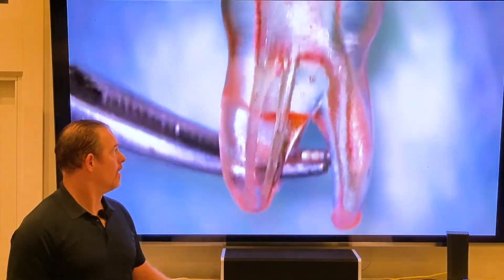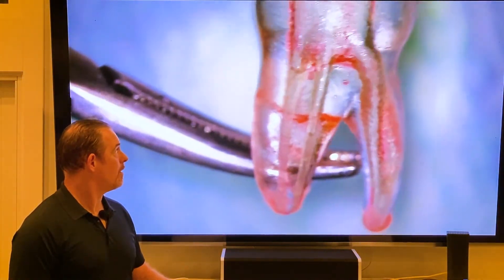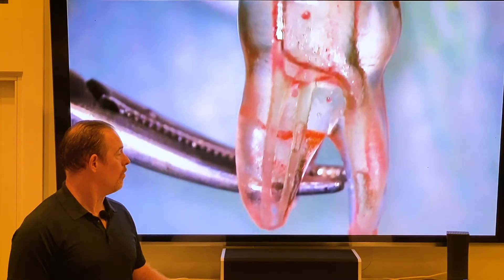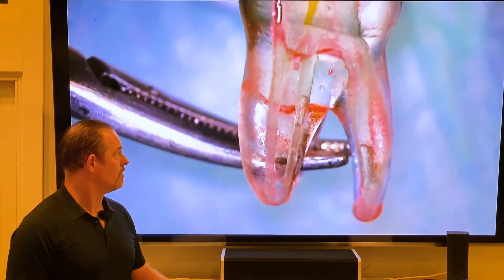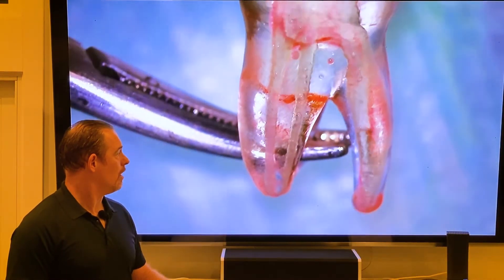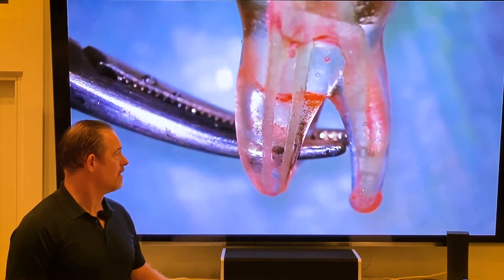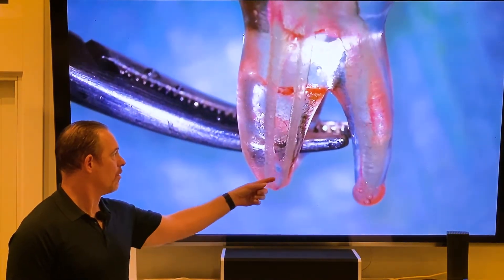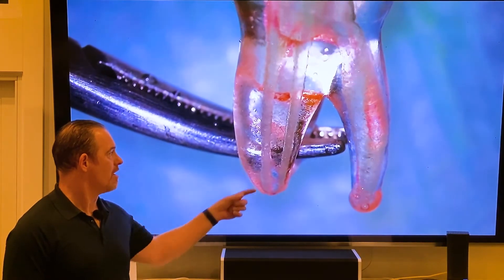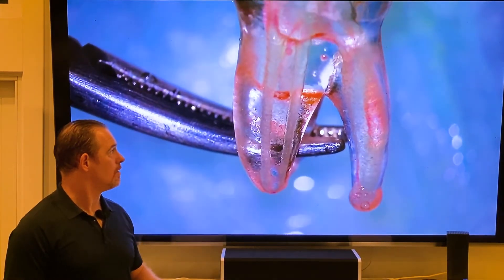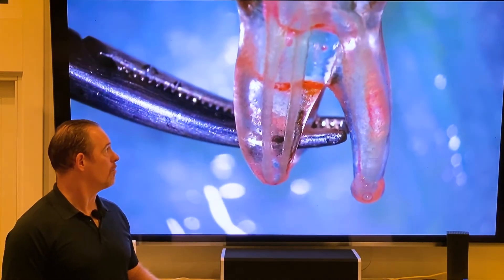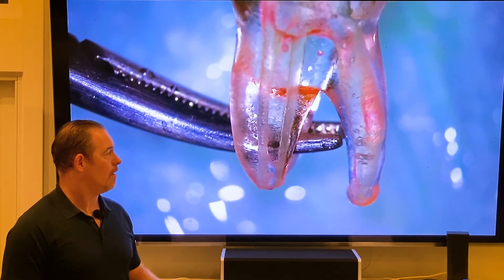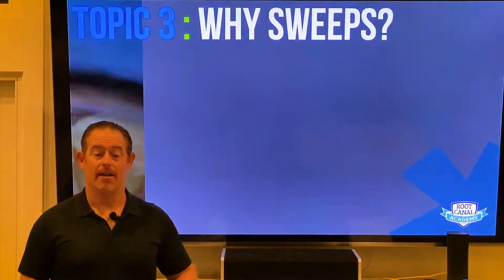Look at the bubbles at the apical third — this is where it's really important to clean out right here. Look at the distal or the palatal root. Pretty cool.